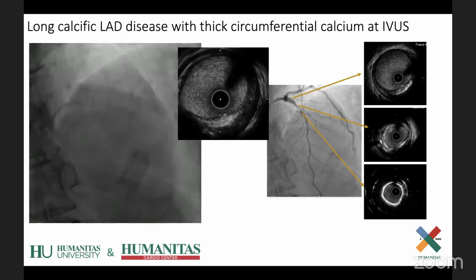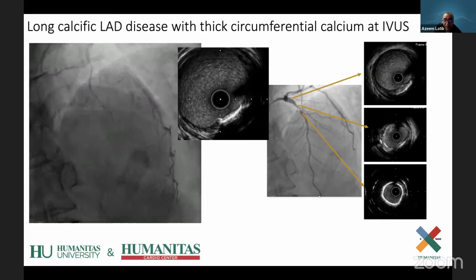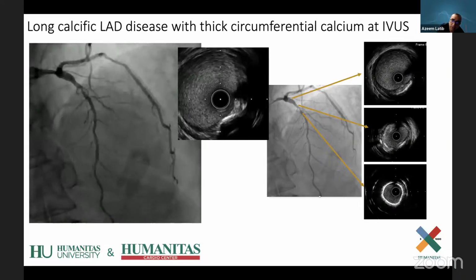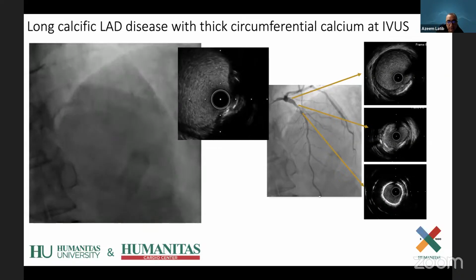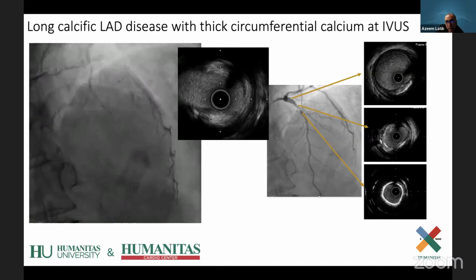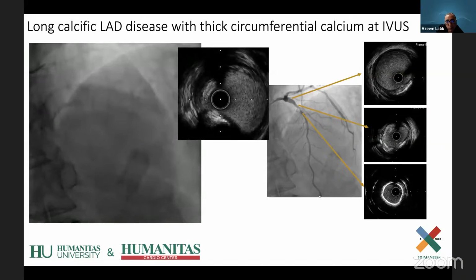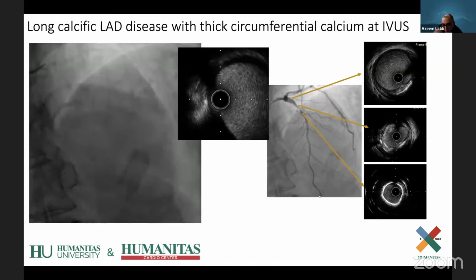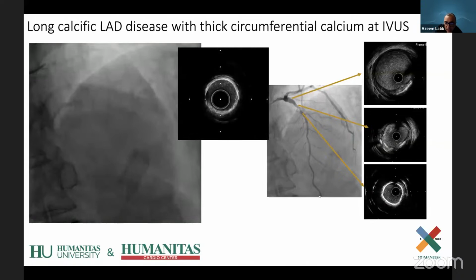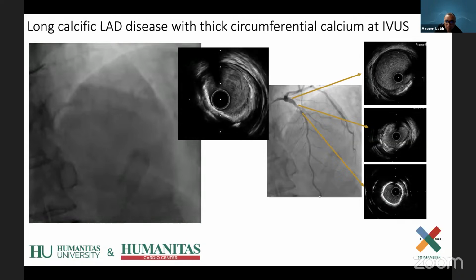And if it is, then with atherectomy you're going to have to go with a really large burr to be able to impact it. So I might try to see if I can get lithotripsy down, even if I have to use a supportive wire, or use a cutting balloon, a Wolverine, which I want to stop calling a cutting balloon because it doesn't actually cut. But that's maybe what I would consider in this case.